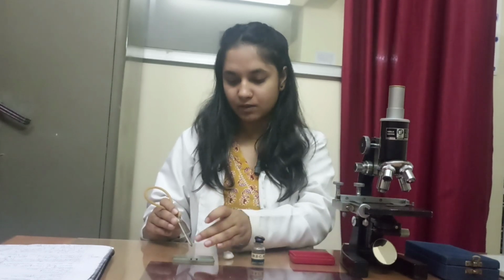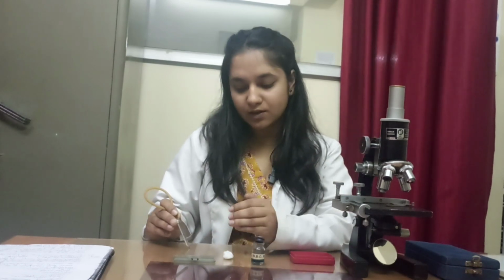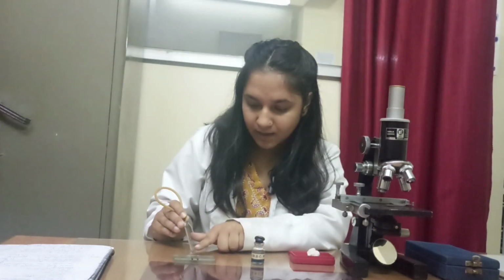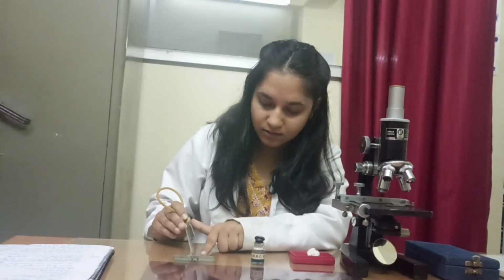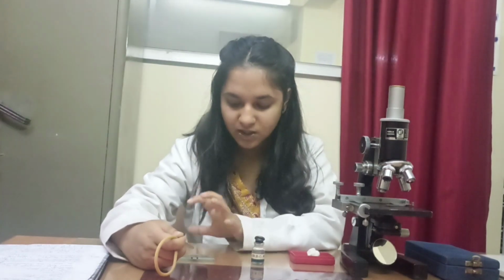First, we should not overcharge this chamber. We should take an equal proportion of solution. We should put this pipette in that way, and from both sides we charge this Neubauer chamber. The Neubauer chamber is charged.